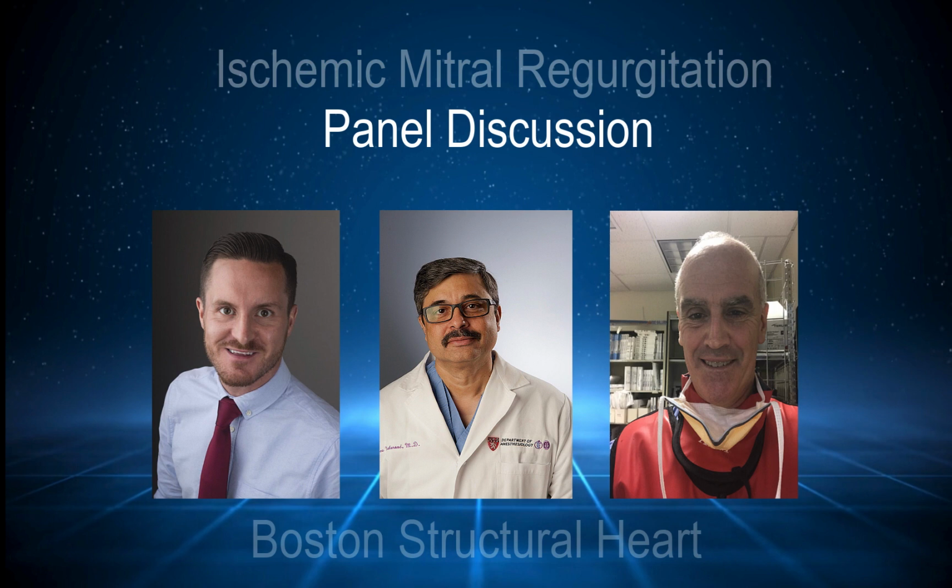When you come down to something like this and you're trying to decide whether to repair or replace, if you're going to tell the surgeon, oh, you should replace it, you should have definitive reasons that are reproducible. Qualitative assessment for the most mild and the most severe is probably reproducible, but anything in between isn't as reproducible.